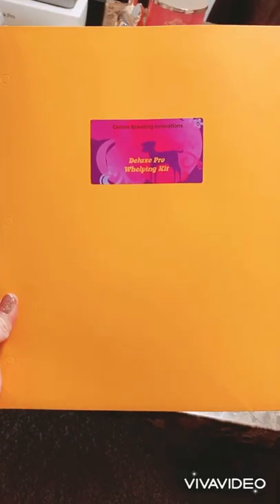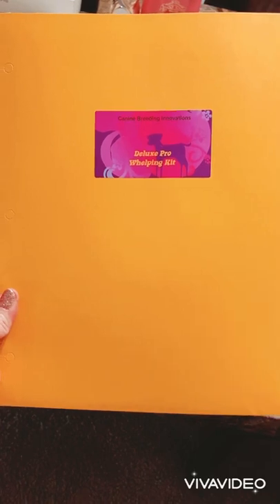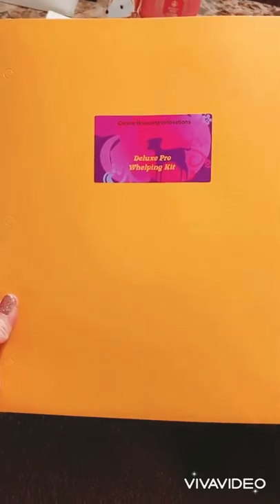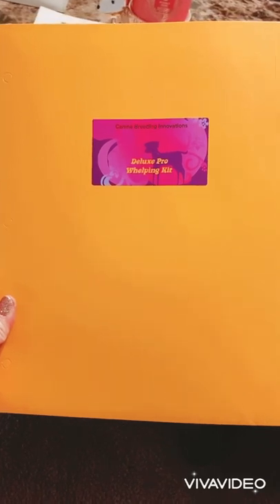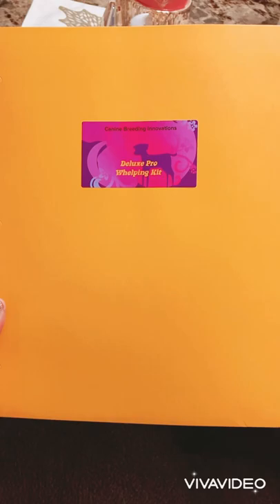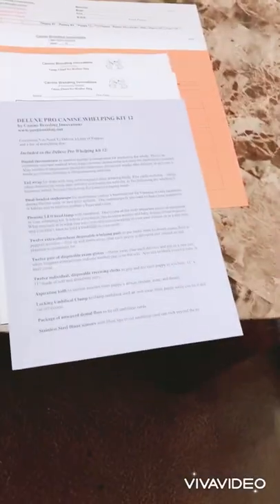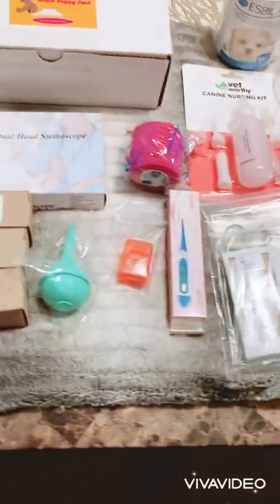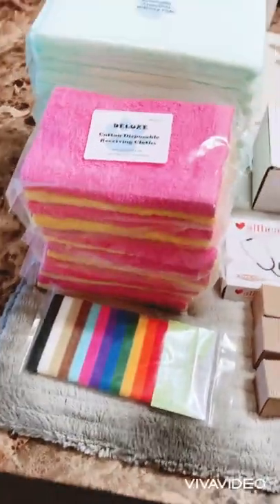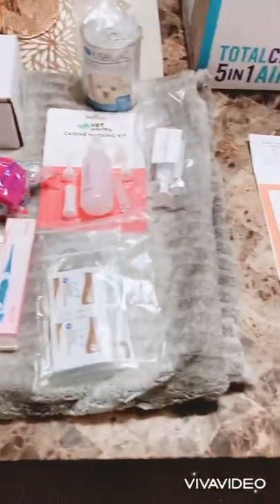Hey guys, welcome back. I'm super excited because today we're going to be going over all of the stuff in the box for the Canine Breeding Innovations Deluxe Pro Whelping Kit. I just unpacked the box and I wanted to show you what was all included. As you can see, it's quite a bit of stuff in one box.